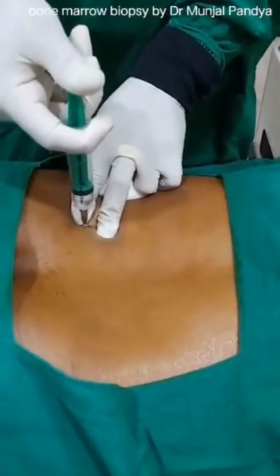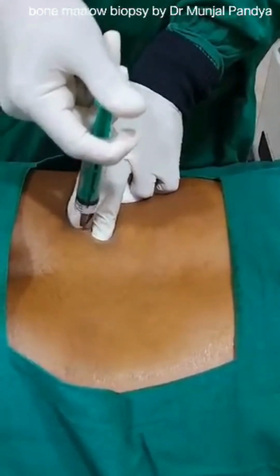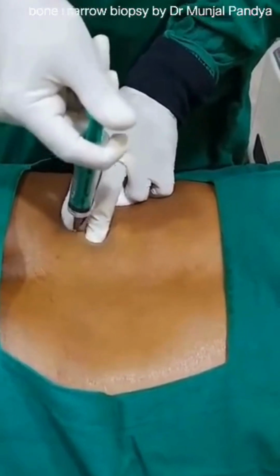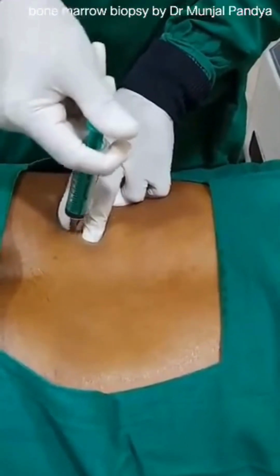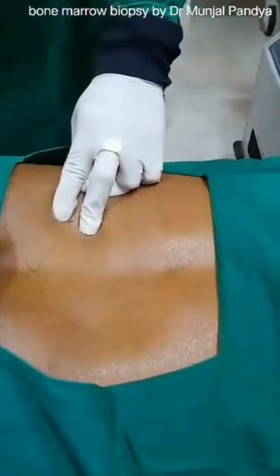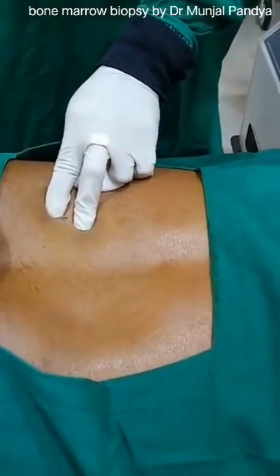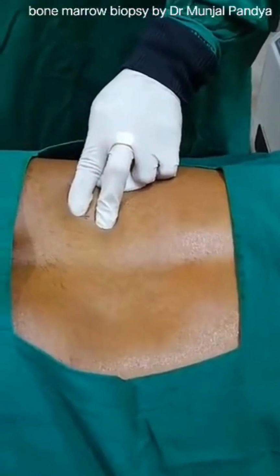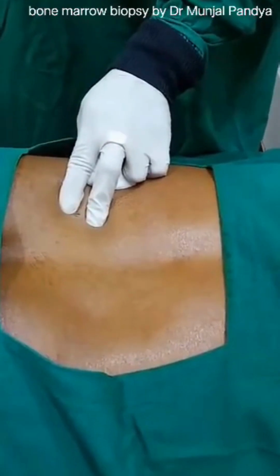When the patient is very obese, maybe 100 kg or more, and the fat is too much, instead of the normal needle you can use a spinal needle to infiltrate the skin, periosteum and bone. So now we are almost done with giving the local anesthesia. Now I am going to make a small incision to facilitate my bone marrow biopsy needle to the bone.